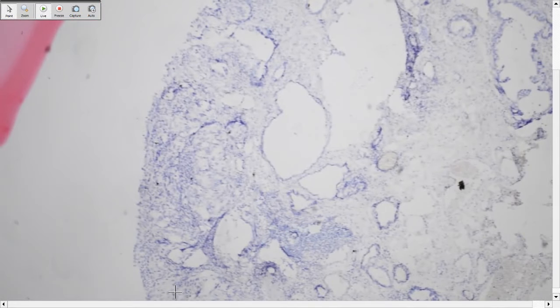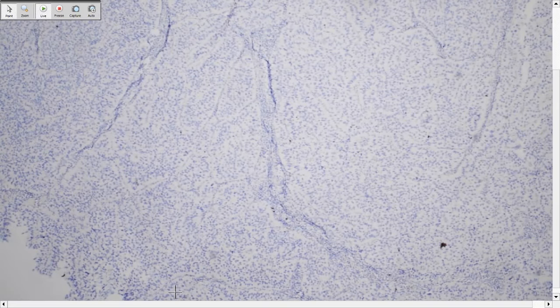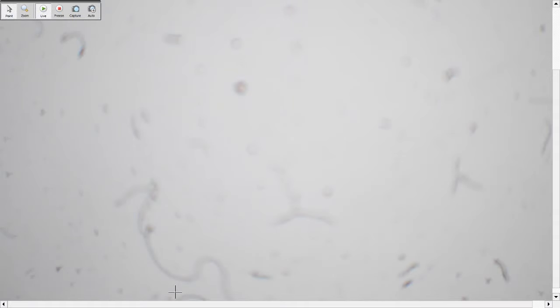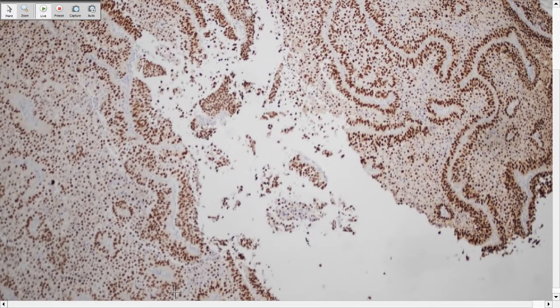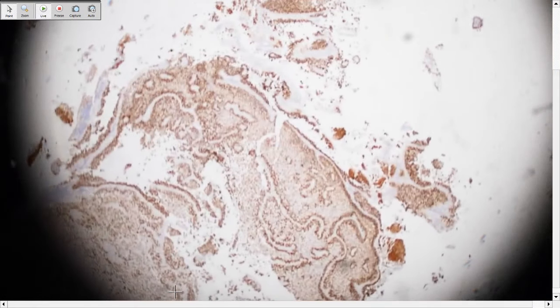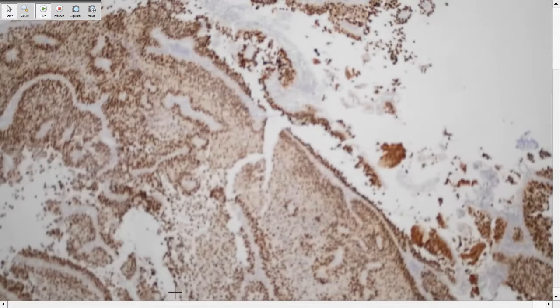PSA negative. I think GATA3 was positive. Okay, PSA is negative. Primary adenocarcinoma, right? So you do NKX and GATA3. GATA3 can be positive, can be negative. Dr. Haynes would just do PSA, but based on his lecture, NKX3 is the most specific.